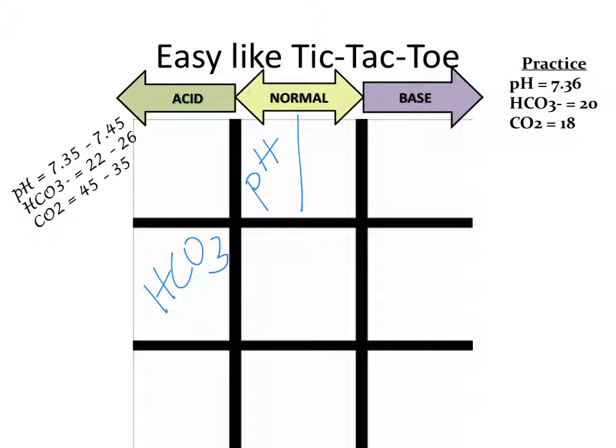That's on the base side. Situation similar before, only opposite. Our pH is normal, so it's compensated. Which value is on the same side as the pH? Our metabolic. So we're going to have compensated metabolic acidosis.